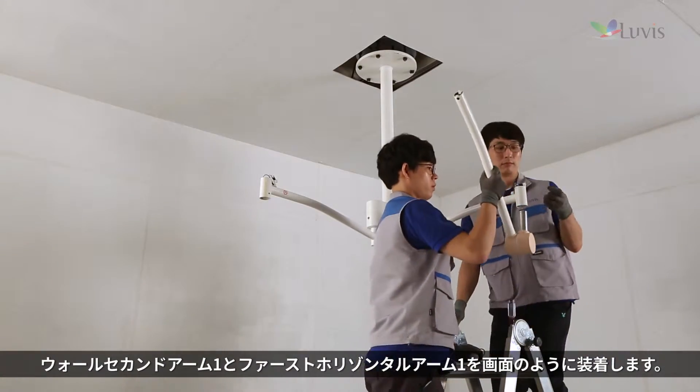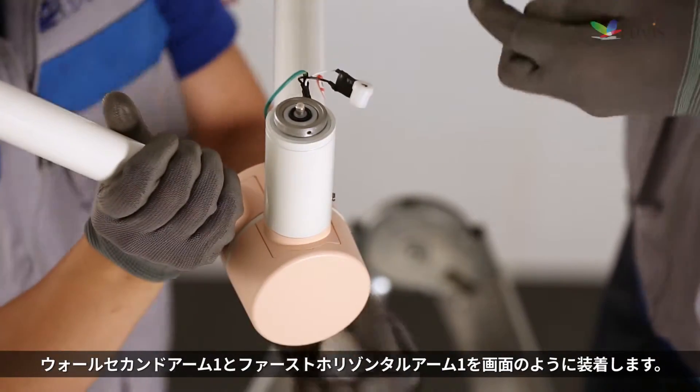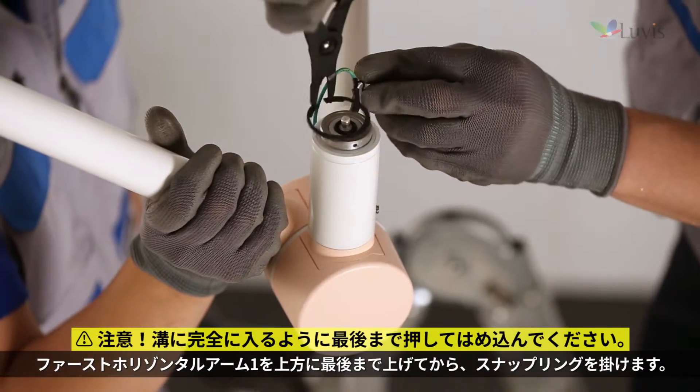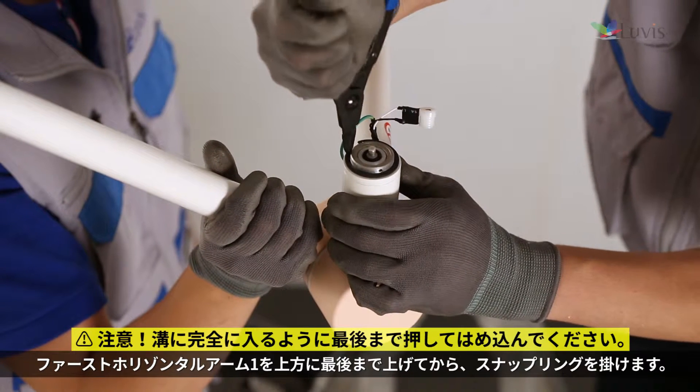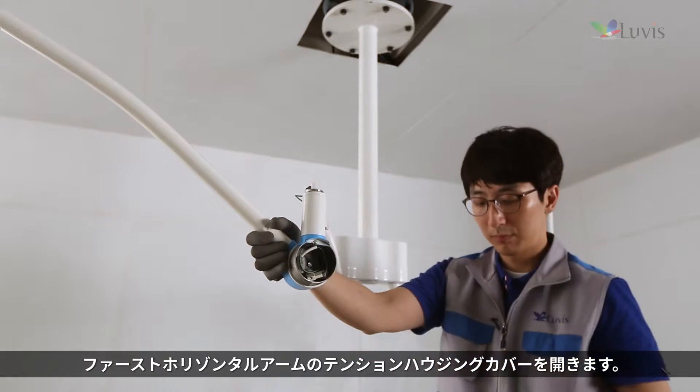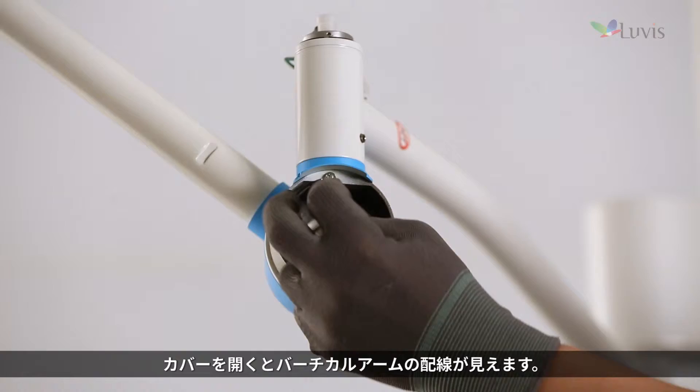Attach wall second arm 1 and first horizontal arm 1 as seen on the screen. Hook up the snap ring after raising first horizontal arm 1 all the way up. Open the first horizontal arm's tension housing cover.